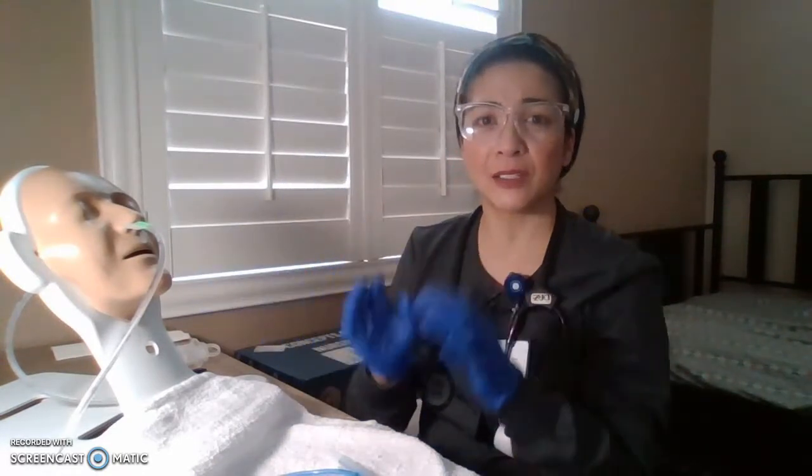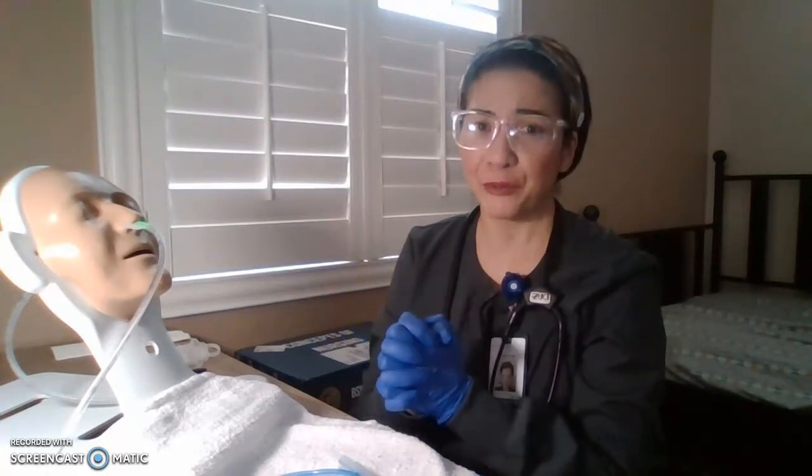And last confirmation, but the most reliable, is a KUB or an abdominal X-ray. It's a kidney, ureter, bladder scan or an X-ray. So definitely do not put any medication. Do not do any feeding until you've done that confirmation, the KUB, all right, or an abdominal X-ray.